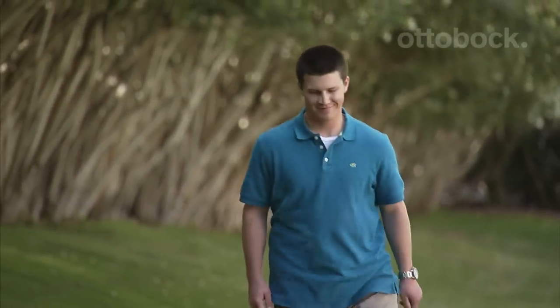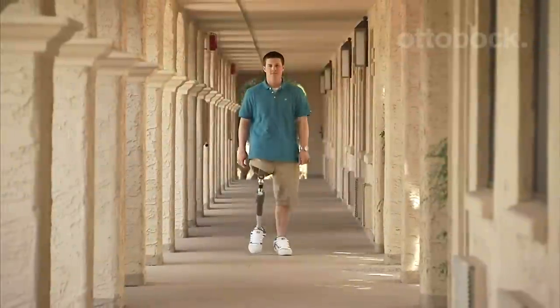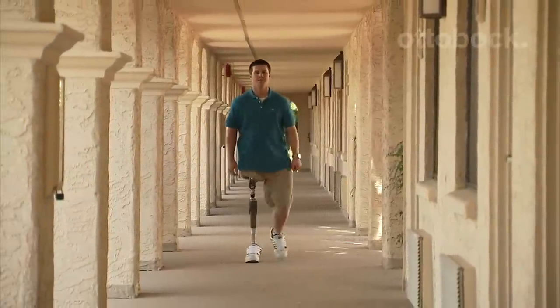You can be more active and mobile. You can have greater stability. You can with the Helix hip joint. Take the right step and ask your practitioner how the Helix and C-Leg could help you find the security and freedom you've been missing.